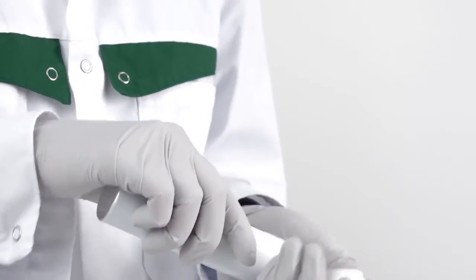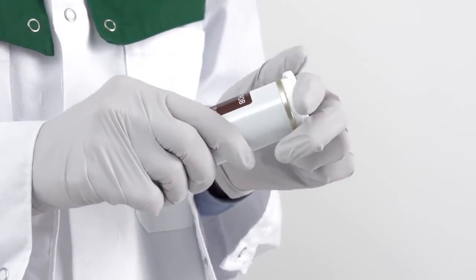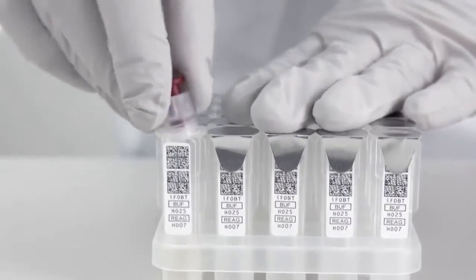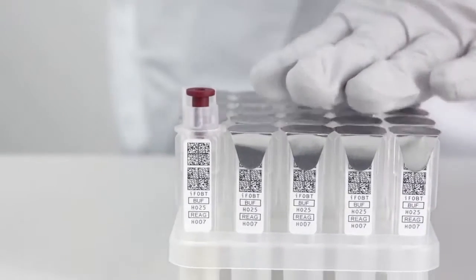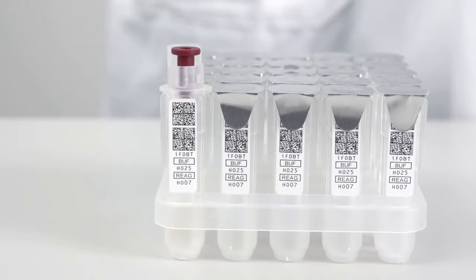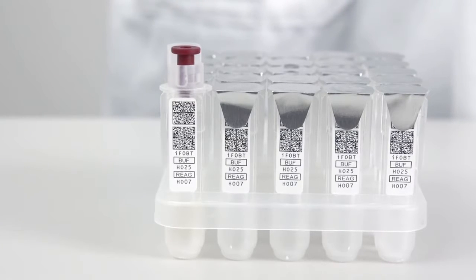Open the tube with the reagent caps, take one cap out, and close the tube. Put the reagent cap tightly on the cuvette in the rack. Alternatively, cap while holding the cuvette from the sides in the hand. The cap is in the right position when the threads are not visible. Take care not to push in the inner brown part of the cap.